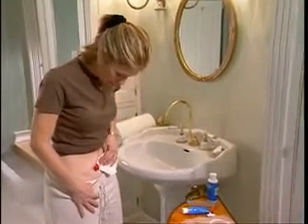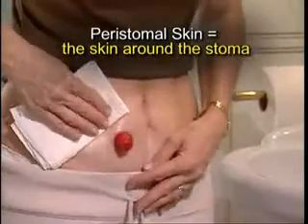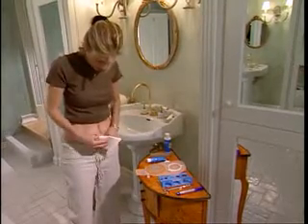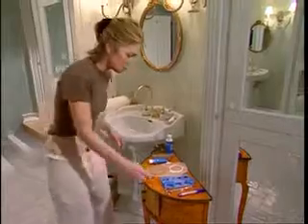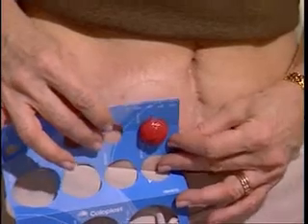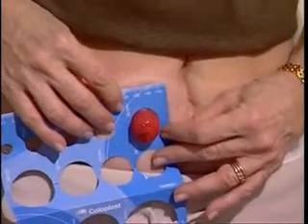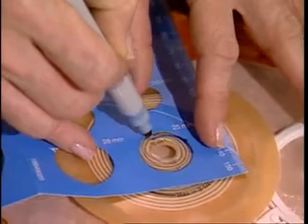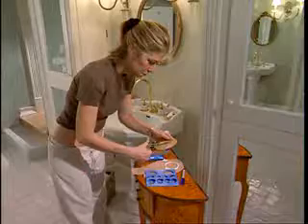This is a good time to look at the stoma and the skin around it. The peristomal skin should look like the skin on the rest of your body, and the stoma should look red and moist. If it looks different or concerns you, contact your ostomy nurse. If you see some bleeding on the stoma, don't be alarmed — some bleeding is normal. During the six to eight weeks after your operation, your stoma will decrease in size as it heals. Measure the stoma once a week during this time, and after that at least once a month. Take the measuring guide provided by your ostomy nurse, place it over your stoma, trace the size and shape onto the tracing guide, and cut it out.